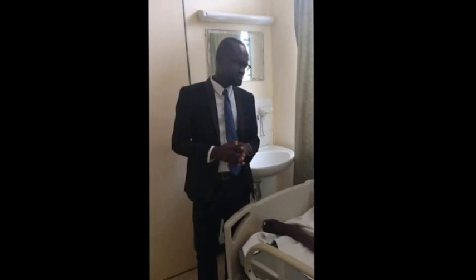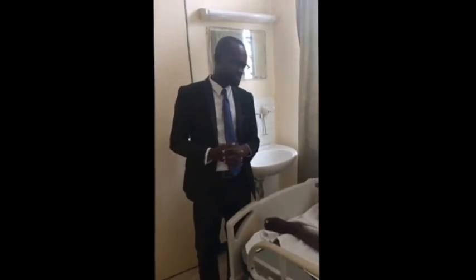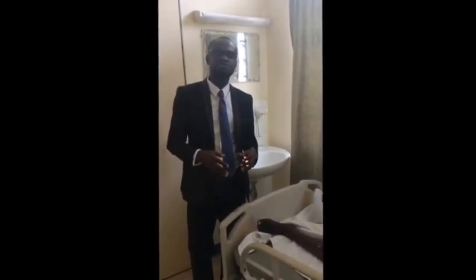To say anti-embolic stockings are good, yes, they are very good, but there could also be some side effects or adverse effects, especially when they are not well applied. And what are some of these adverse effects?